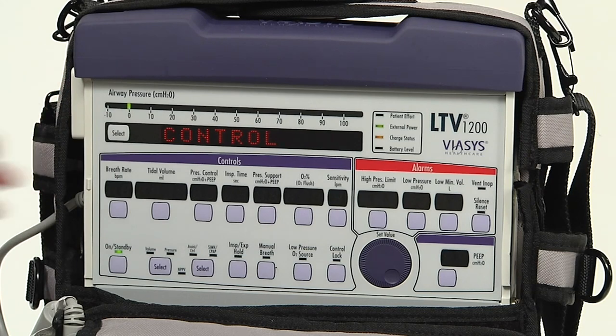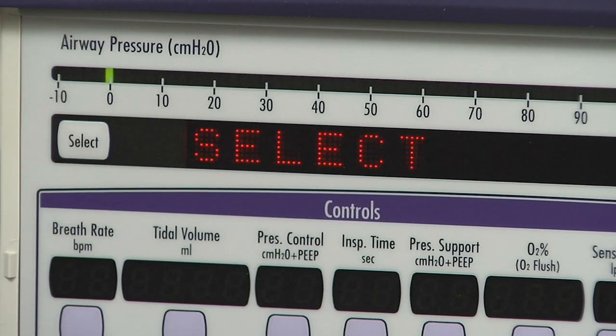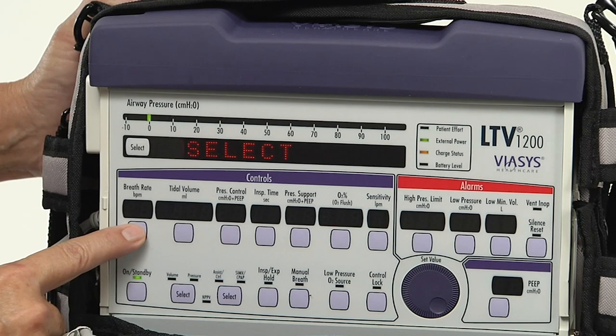To end the display test, push the select button once more and the next menu item is displayed. Use the control test to verify that the ventilator buttons and the set values knob are working correctly. Push the select button while the word 'control' is visible in the display window. Test each control button by pressing them one at a time.